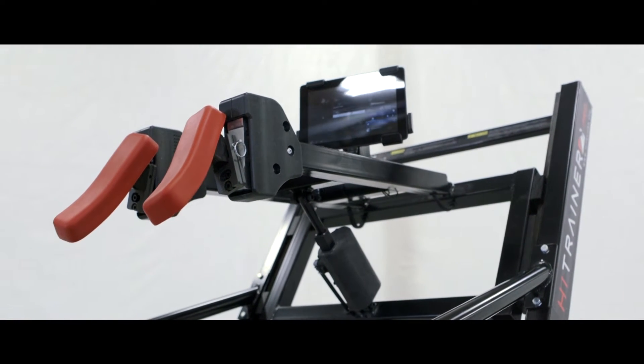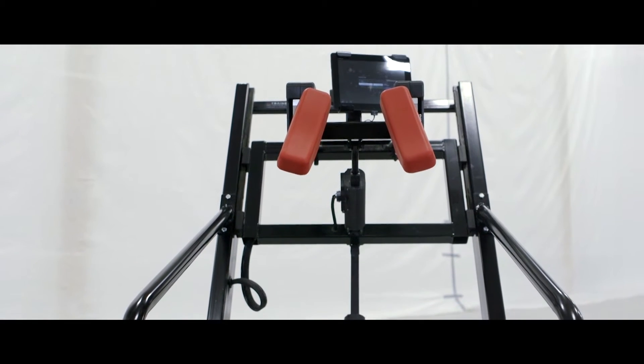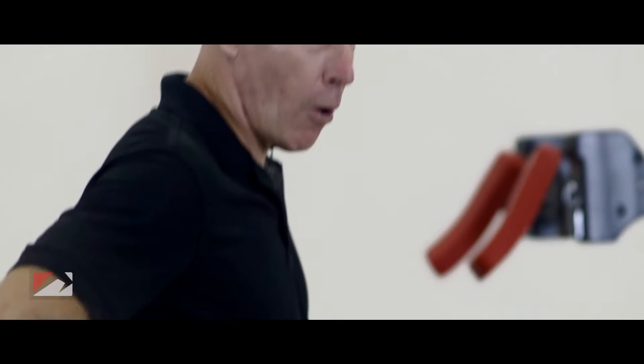This is the Hightrainer Pro. It's a cutting edge of evaluation, conditioning, and speed and power development. It has no motor — no motor, no problem, no breakdown.